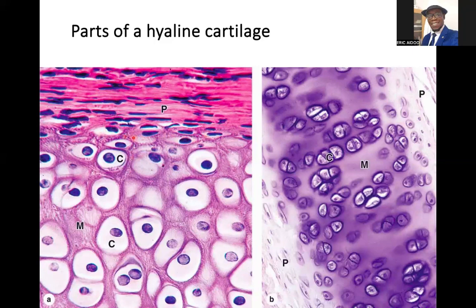Then these chondroblasts, which are the younger forms of the hierarchy of growth in the cartilage, end up growing towards the middle portion. So here there's hypertrophy. So this is also a chondrocyte, which means an adult chondroblast. So they are moving towards the middle portion. That is the matrix or the extracellular substance down there within which the chondrocytes and chondroblasts are swimming or embedded.